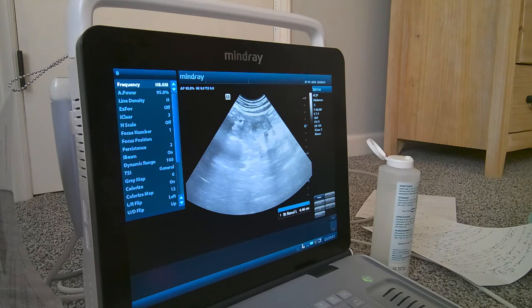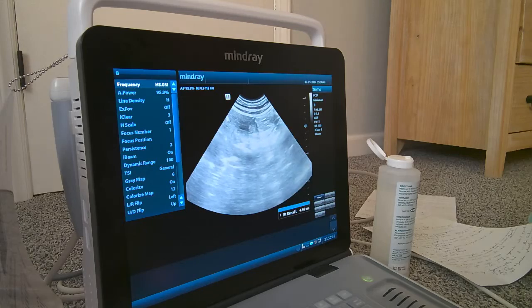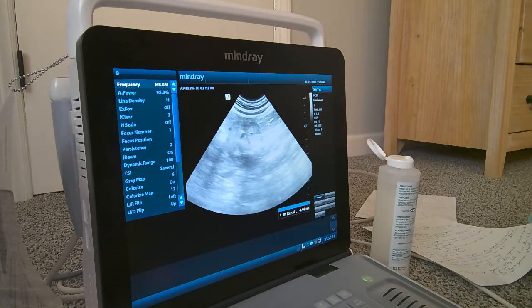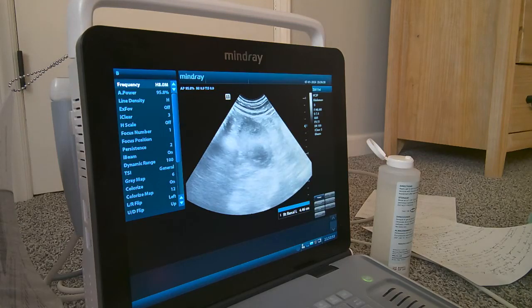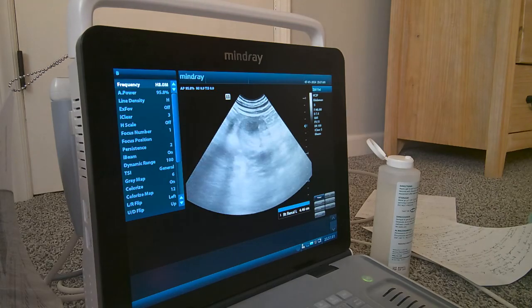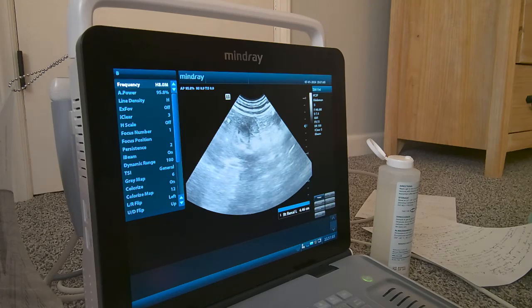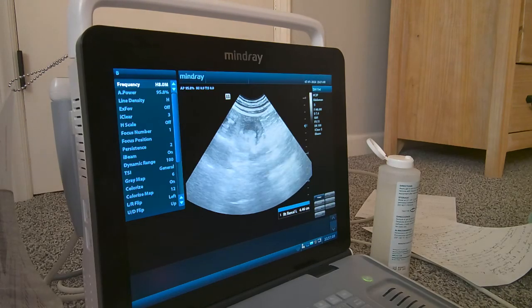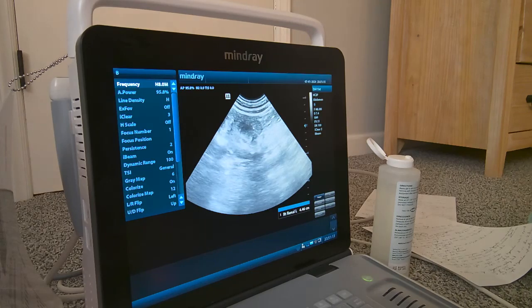The renal pelvis is just going to be the area, kind of like the collecting system, right before it goes into the ureters. So it's going to be a very thin anechoic region. It looks like a clown face occasionally when we're looking at that renal pelvis. If you're worried about a pyelonephritis, a lot of times there's some pyelectasia, or dilation of that renal pelvis. Most of the time it should be 2 millimeters or less. So it's going to be a really, really thin kind of black line of fluid.